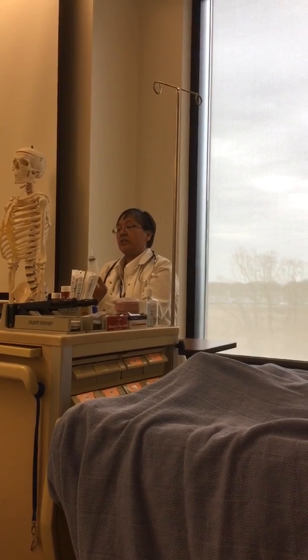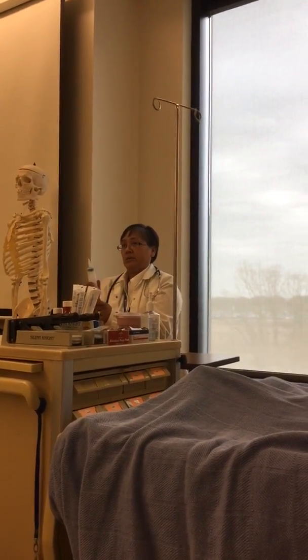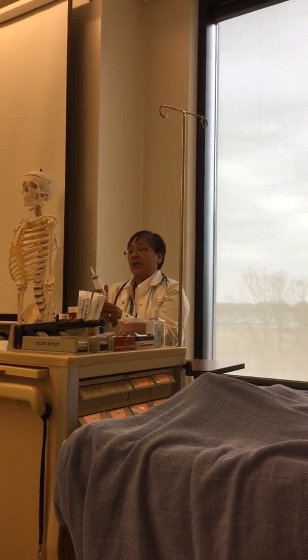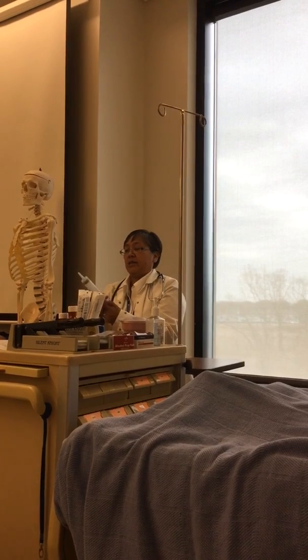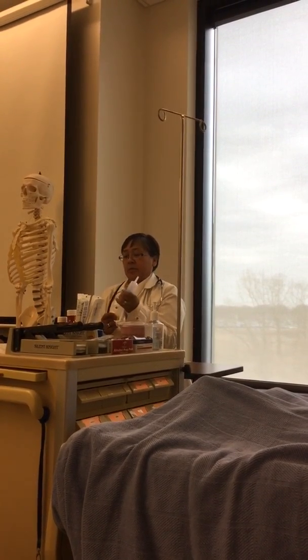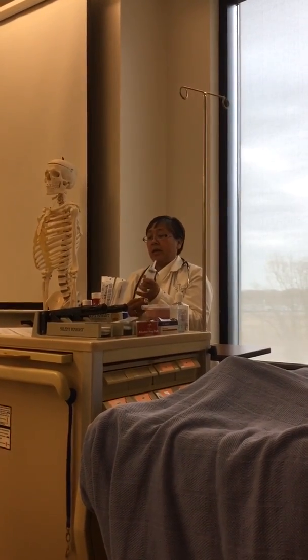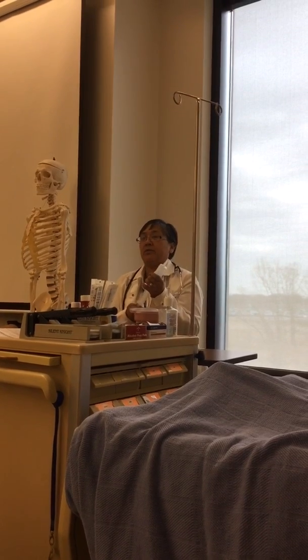Your syringe, this is called a Toomey syringe. It has a blunt little tip applicator, and you can see it's pretty big. This looks like a 70 cc, 80 cc syringe, okay? And if you're opening something new, I always tell students to just kind of play with this.